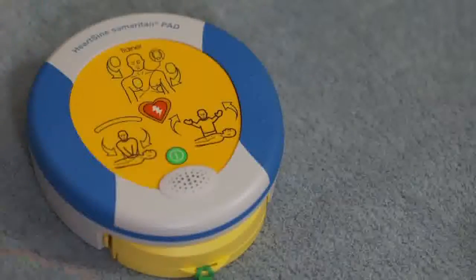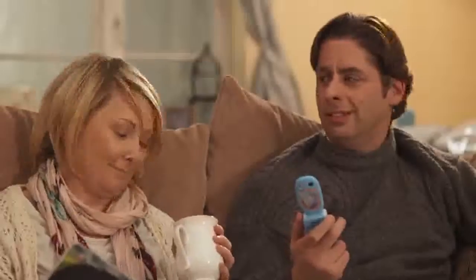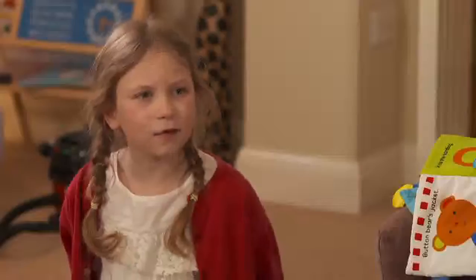You push this button to turn it on. It's very easy, Daddy. Even you'll understand it. Call for medical assistance. Get a move on, Daddy.